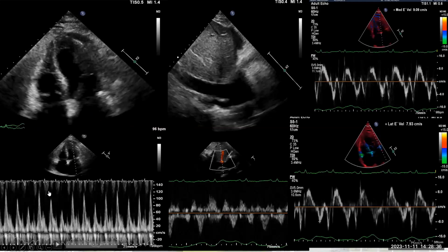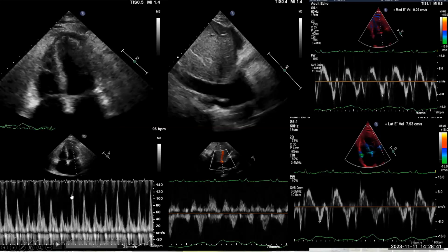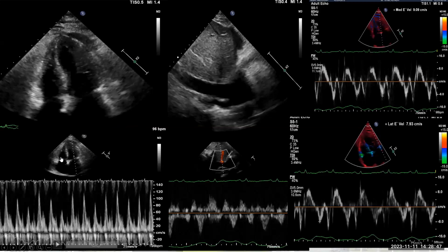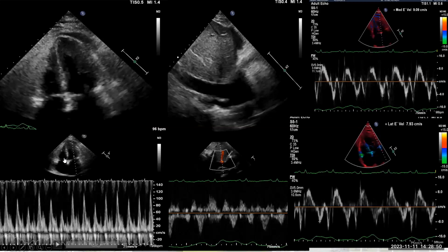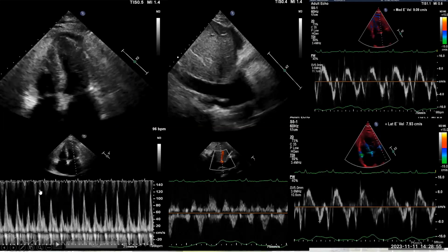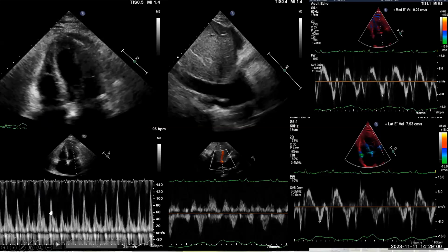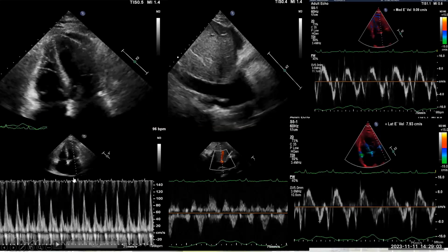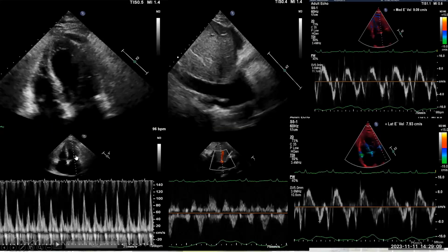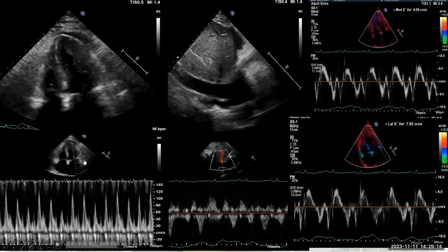In mitral flow, we have respiratory variation, and the significance of respiratory variation in mitral inflow is if more than 30%. In some books they say 25%. In the tricuspid valve, at least 50%. We can see here that the difference between the highest peak of mitral flow and the lowest one is more than 40 or even 50%. So this is suggestive of significant respiratory variation across the mitral inflow and indirectly suggestive of ventricular interdependence.